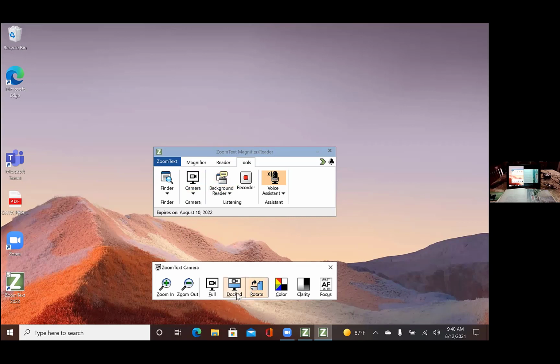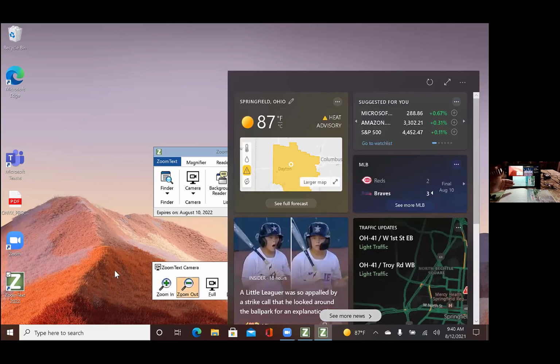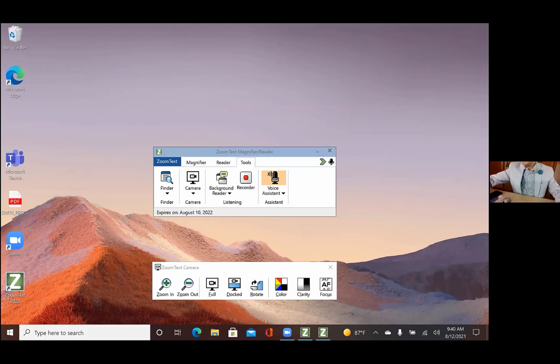It's nice that you can choose where you want that docked, whether side by side, top or bottom split. And it's nice to give you that split of the screen. So you may have something magnified here on the bottom or wherever you choose to have it. And then you may decide that you're copying material into a Word document or something like that. And so we did want to show that, and unfortunately, it doesn't show through Zoom. By design, yes. And so I'm going to flip us back around here, and you get to see my lovely mug again.